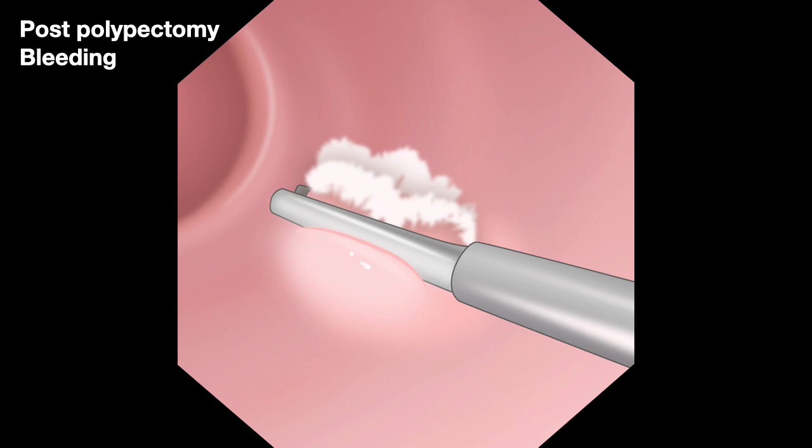Ask your assistant to open the clip, and when you are sure that you can close that vessel, ask the assistant to close the clip, and then wait for a few seconds, and then ask the assistant to deploy. So open clip, close clip, deploy clip. Those 3 steps should be followed religiously so that you do not prematurely deploy a clip and then find that you have not controlled the bleeding. Very important to keep in mind.